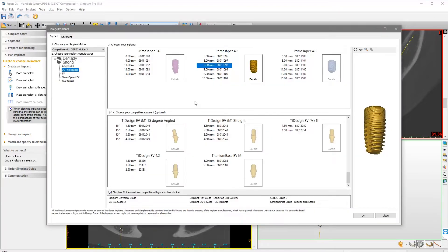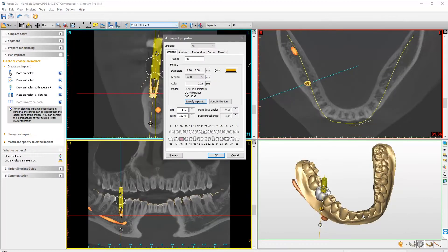The Implant Library window appears, showing all implant diameters of the currently selected implant type. You can navigate through the left panel to find other implant models from the same manufacturer or choose a different manufacturer. If you cannot find a particular implant type or manufacturer, please check the type of Simplant guide currently selected, as the implant library filters out the implant types not compatible with the guide type selected. Click OK to close the implant library, and click again OK to close the implant properties window.